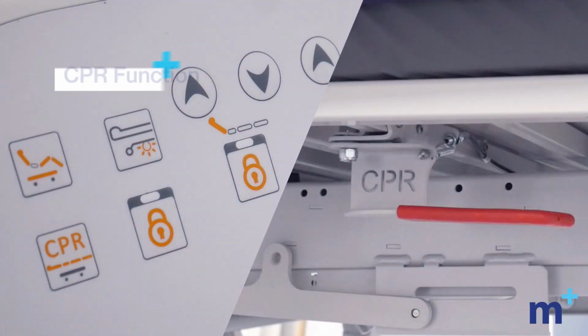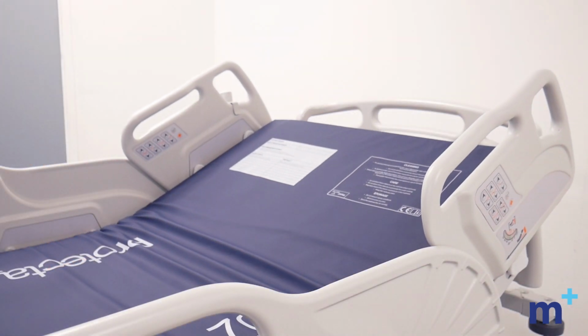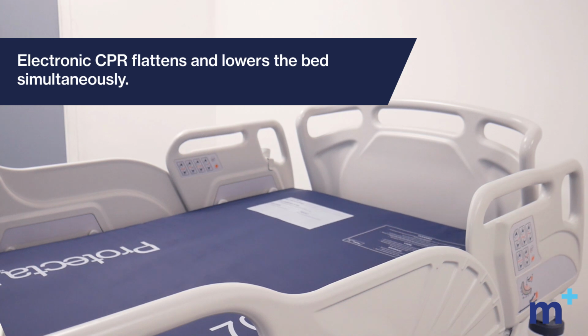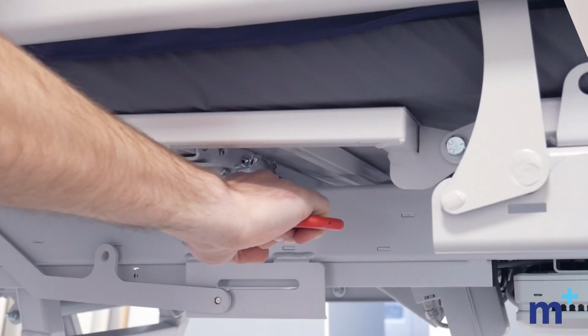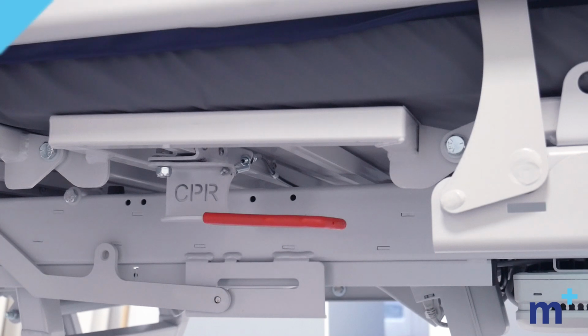The Versatech 700 is equipped with both a manual and electronic CPR function. Electronic CPR flattens and lowers the bed simultaneously. Manual CPR is located on both sides of the bed. Pull the red lever outwards to lower the backrest back to flat.